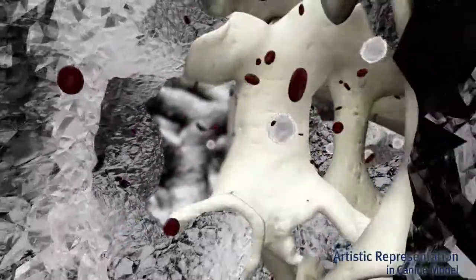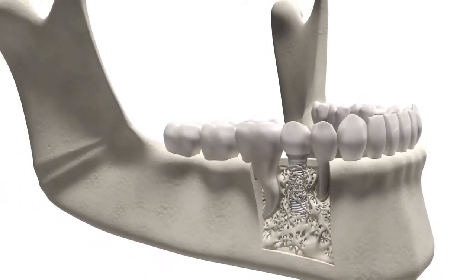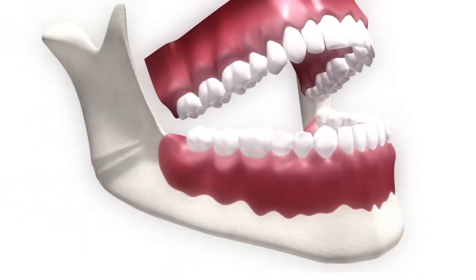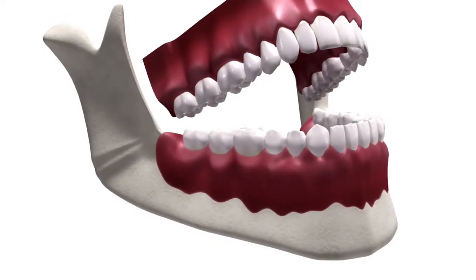Further research is required to determine the rate of ingrowth and its effects on secondary stability in human dental applications. The trabecular metal implant adds a new dimension to dental implantology with a unique combination of texture and porosity.